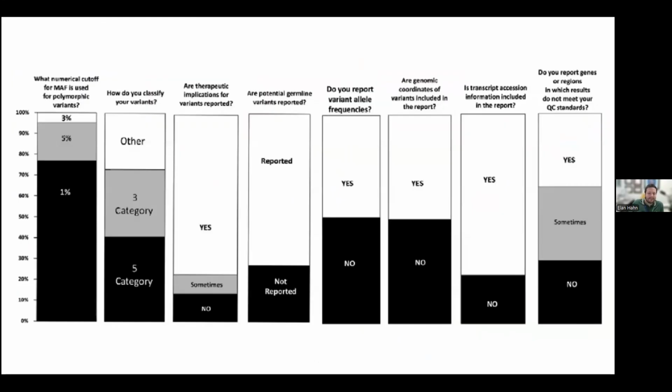To broadly assess the current practice of NGS testing for tumor tissue, technical and reporting groups were surveyed by a survey prepared by the AMP working group. 67 responses were received for the technical survey, 44 for the reporting survey, and most people responded that their panels included up to 100 genes. Most of them detected single nucleotide variants, 95%, 35% detected CNVs, and 37% detected fusions. So there was a lot of variability, which prompted the creation of these standards.